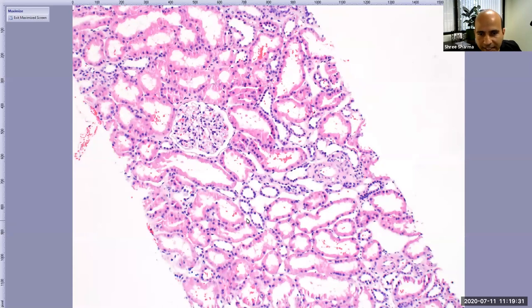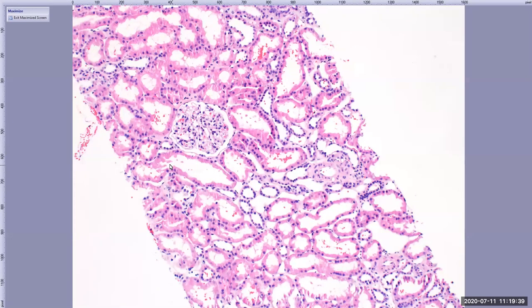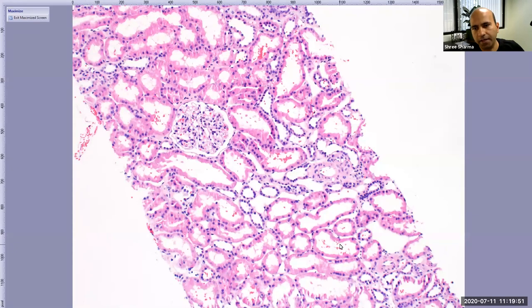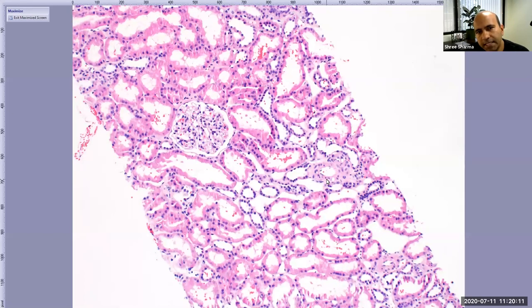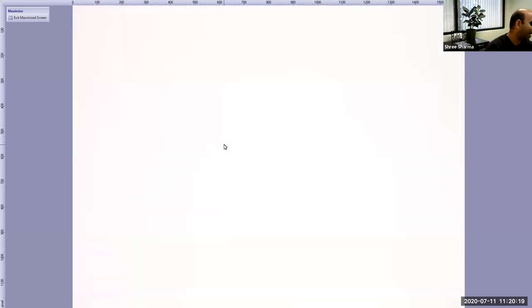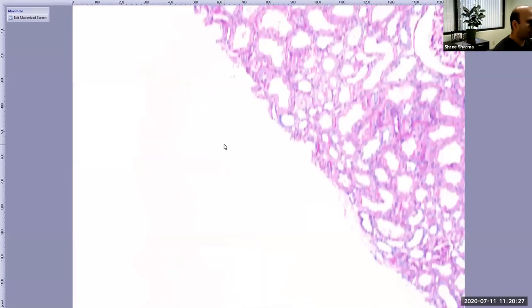In H&E I'm not seeing any other cells between the tubules — the tubules are very close together. That's why I'm calling this normal. To go deeper on morphology, I have to use the PAS — periodic acid-Schiff — stain. On PAS staining, you can appreciate endothelial cells sitting on the intima, the muscularis layer is not thickened, and if there were fibrosis you would see fibrous tissue in between.